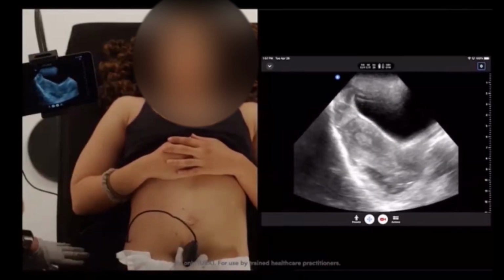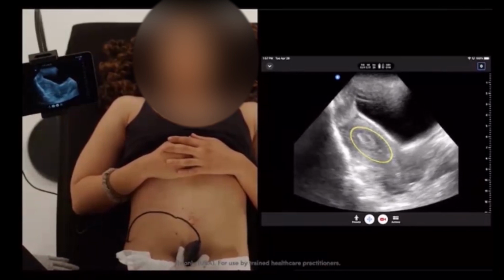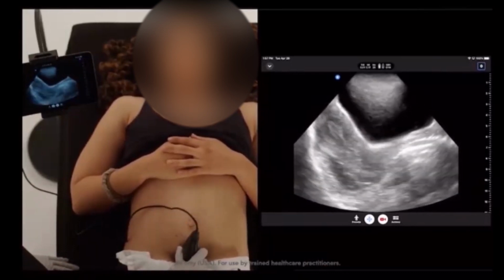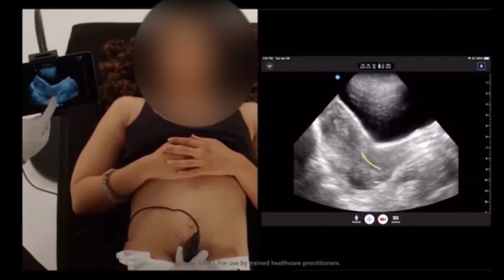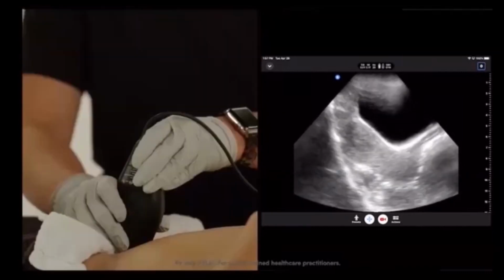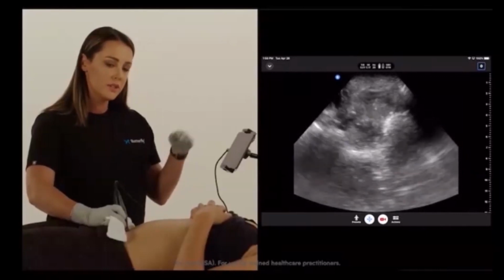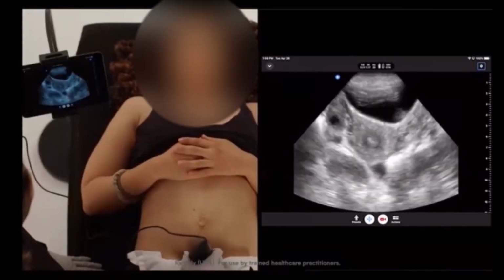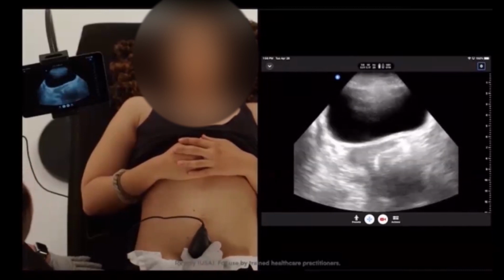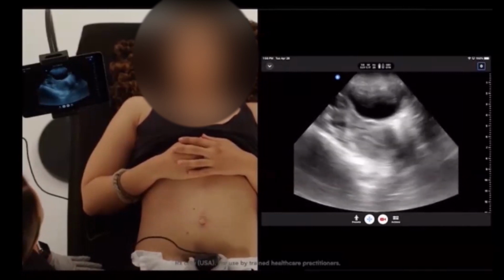So once I've scanned all the way through, in this view, the long axis of the uterus, you can also see the endometrium lining really well. So this is a great view if you wanted to measure that. You can also focus more inferiorly to the patient's cervix. And once you've gotten all of those in view, I'm going to turn my probe to the transverse view and then fan up to the patient's fundus. And then just do a sweep from fundus to cervix. Fanning down. Okay, once we've done that, we're going to stop her there. So that's just kind of showing how to do the sweep of the uterus in both the sagittal and transverse plane.